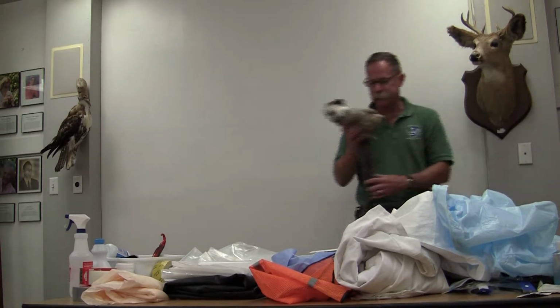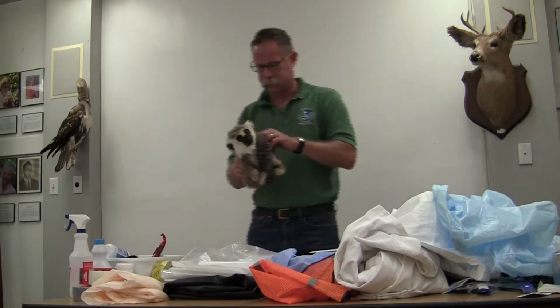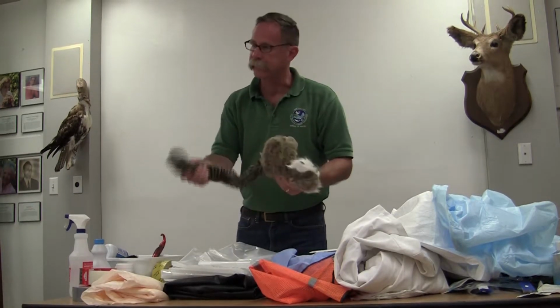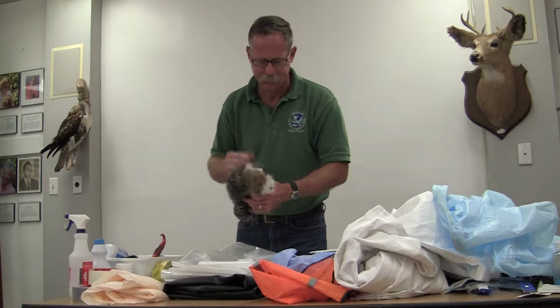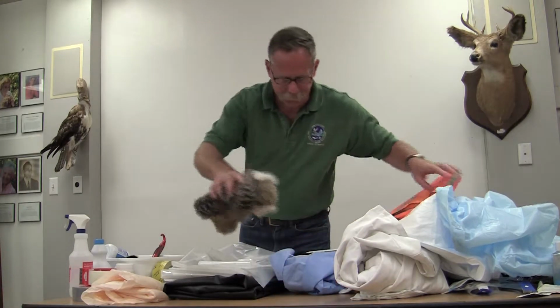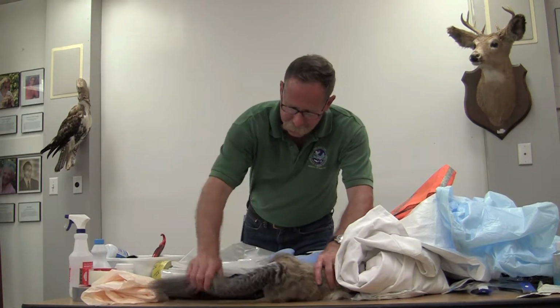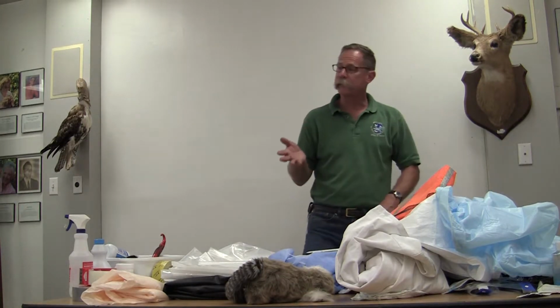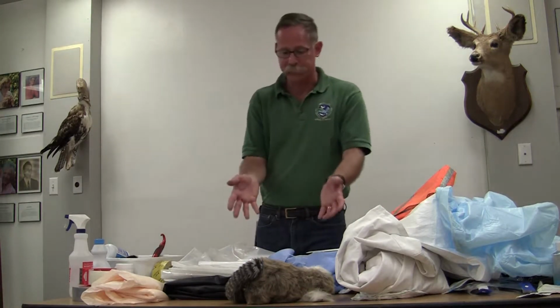So I brought this raccoon surrogate with me from my daughter's collection when she was younger. This one's got a really good tail for loading up with blood and splattering around. I'm going to set it here on the table in a normal death posture that you would encounter in the field. You want to use a bag that's appropriate to the size of the specimen.